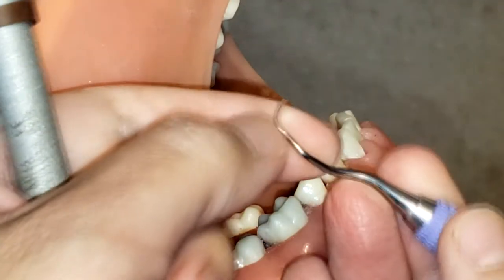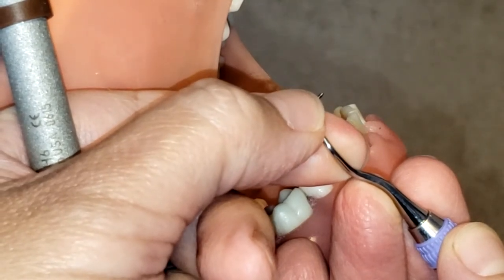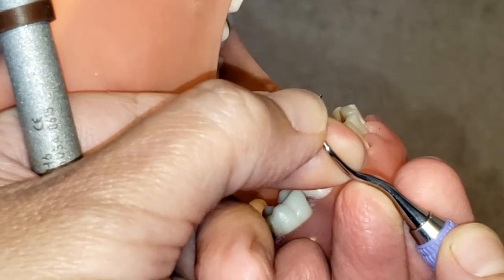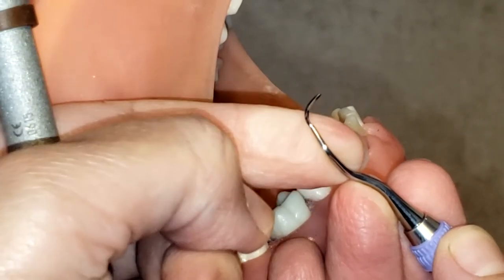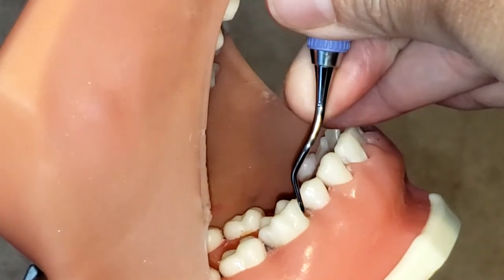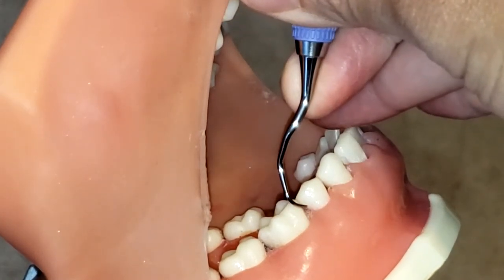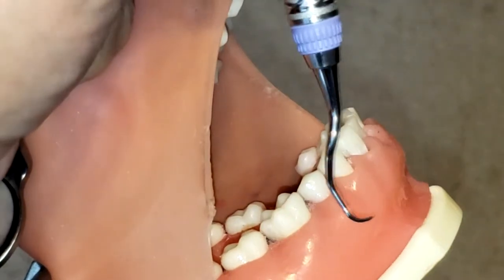Make sure you have the correct working end. For this instrument, you have to make sure that you are using the toe third — just the side of the instrument and a little bit more, about that much of the instrument — that is going to be in contact with the tooth surface at all times, so that the point is not sticking out and you do not lacerate the tissue.